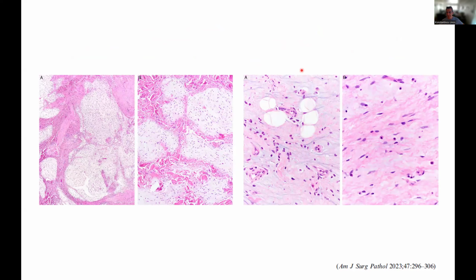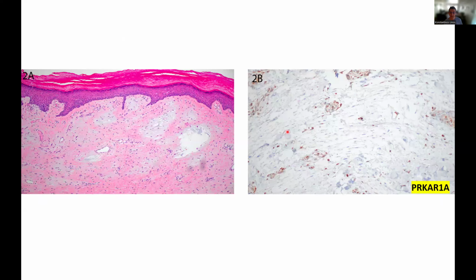This shows a multilobulated plexiform growth pattern with a lot of myxoid background and delicate small capillaries. Many times this tumor has infiltrative neutrophils, which can be a clue. We know now that the PRKAR1A mutation is not just in Carney complex-associated but also in sporadic superficial angiomyxoma. Your main differential, if you see it in the skin, would be acrofibromyxoma, or digital fibromyxoma.